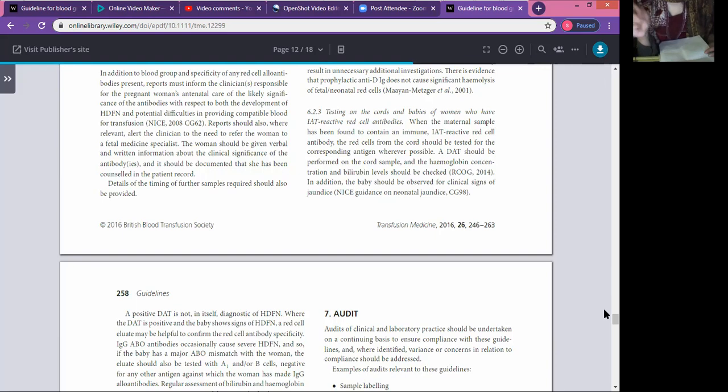Then regarding anti-C, there is no special reference made, just the titers are important. Regarding anti-K, of course, we'll go about doing the double titration method, and antibodies more than 32 are a severe risk. For this also, if the father is heterozygous, cell-free fetal DNA should be done to determine the KEL star 01 assay, because these are the fetuses which need vigilant monitoring, even if the father is heterozygous for expression.